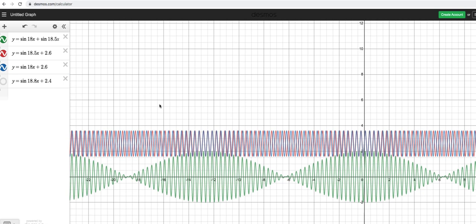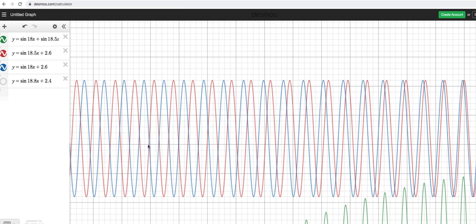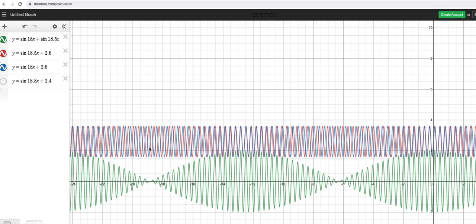Now what do you see here? Something that is really interesting. I'm going to zoom in here. The peaks of the red and blue frequencies are quite separated at this position. Red is not superimposed on blue, and blue is not superimposed on red. The peak of the red is in a totally different direction from the peak of the blue. When these two frequencies are in totally different directions, you see a cancellation of the two frequencies, and that's the reason it goes down.